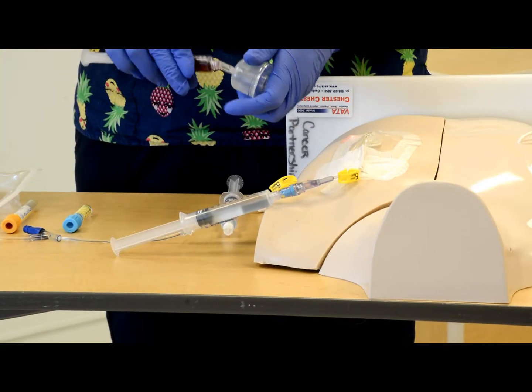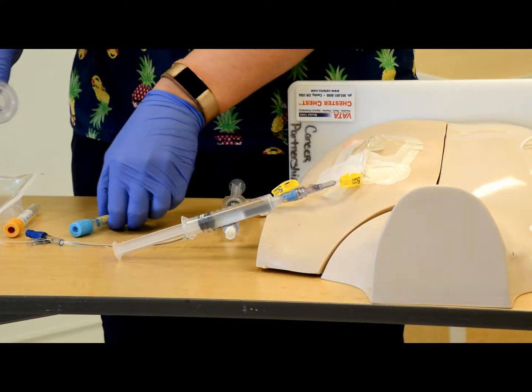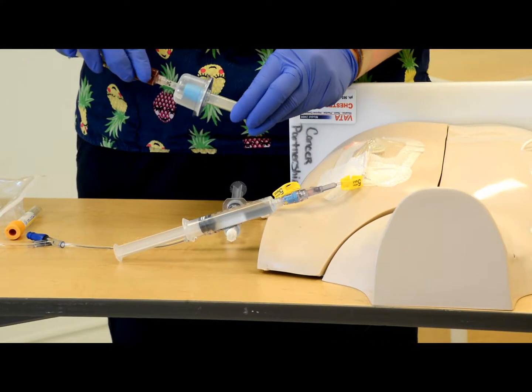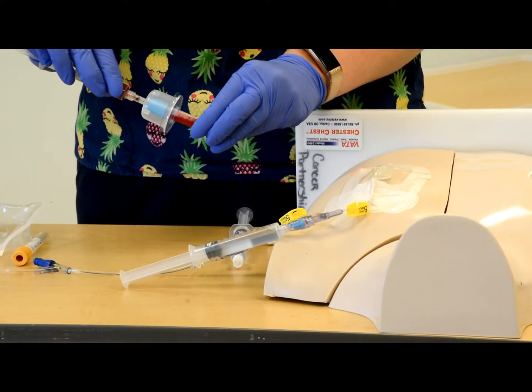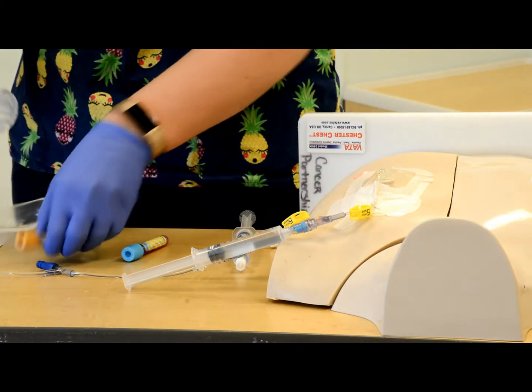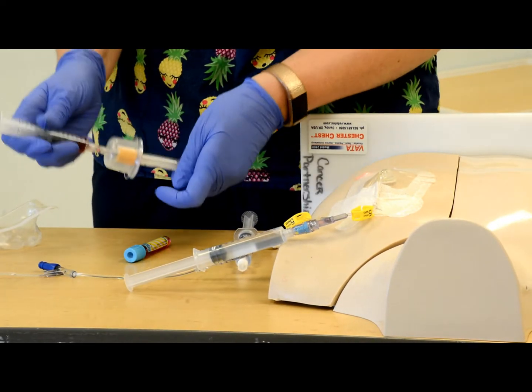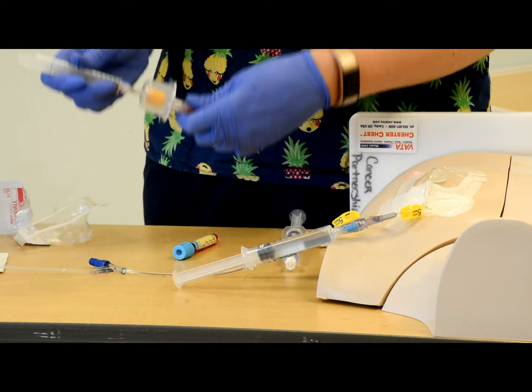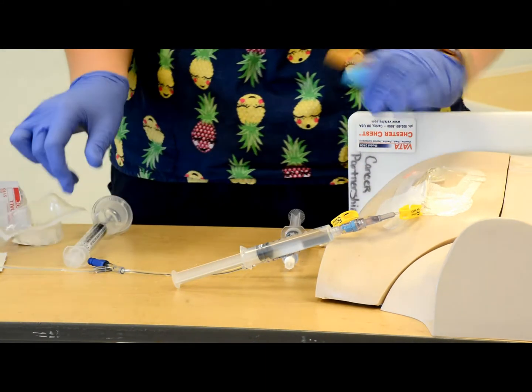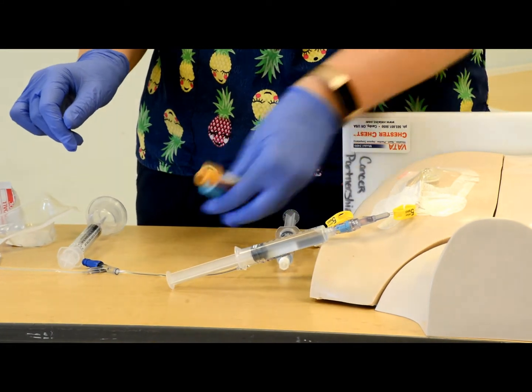Then I'll put my syringe on my transfer device. And in remembering order of draw per manufacturer's recommendation, we're going to fill these tubes. And then make sure you do a gentle mix.